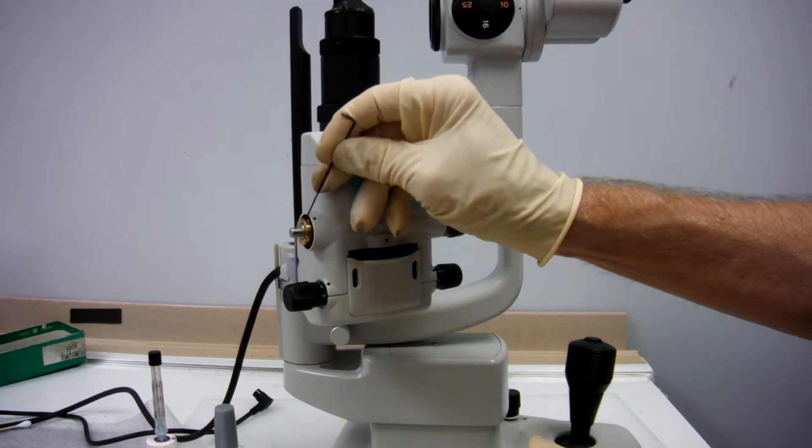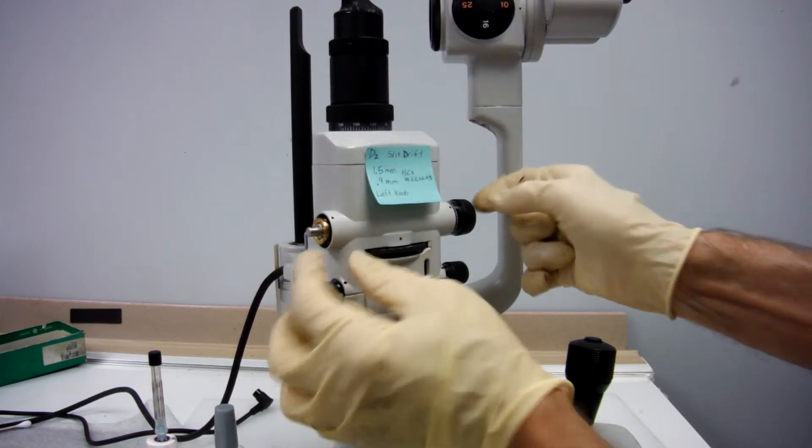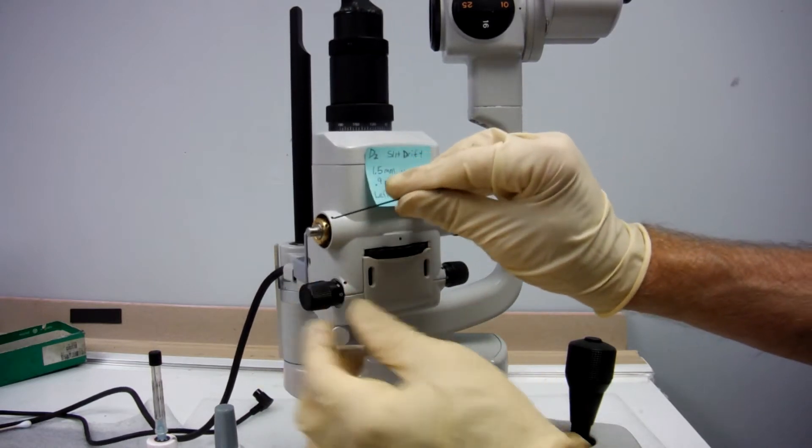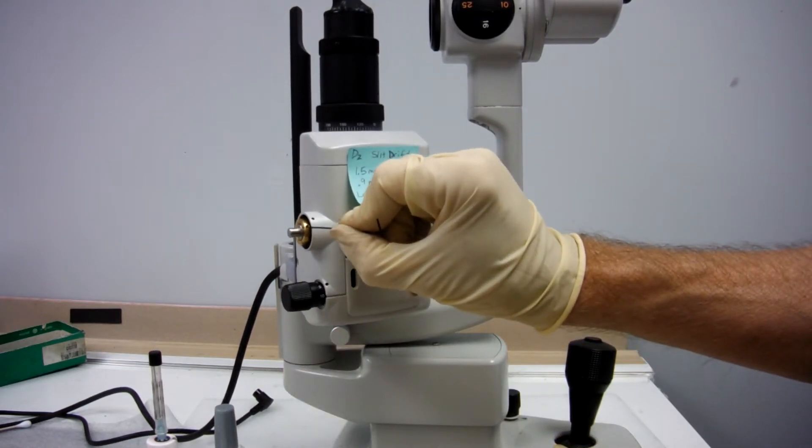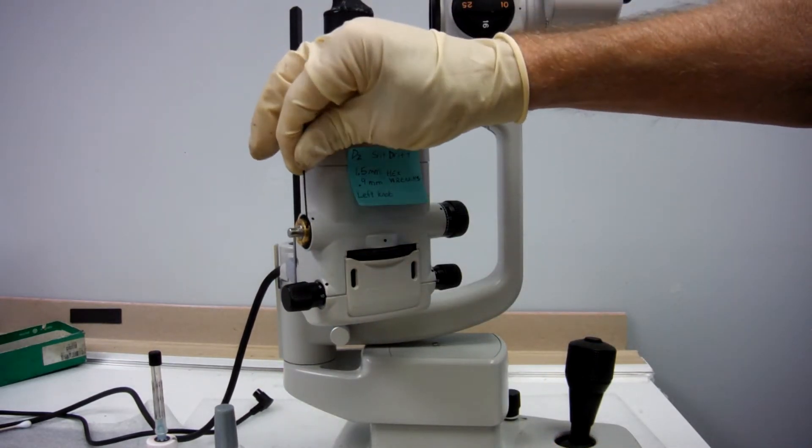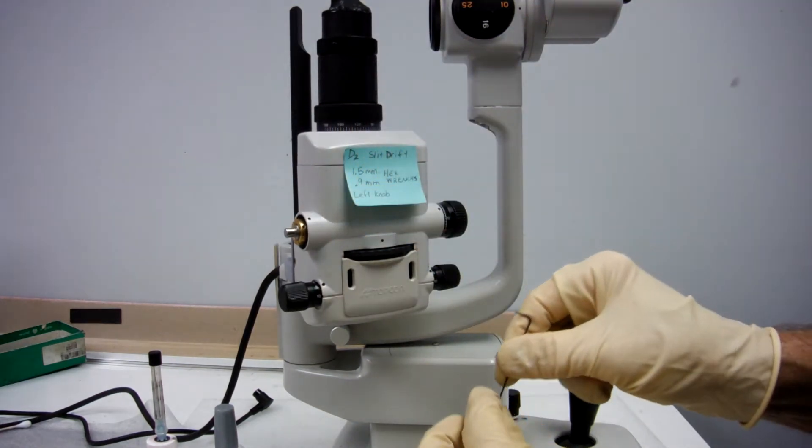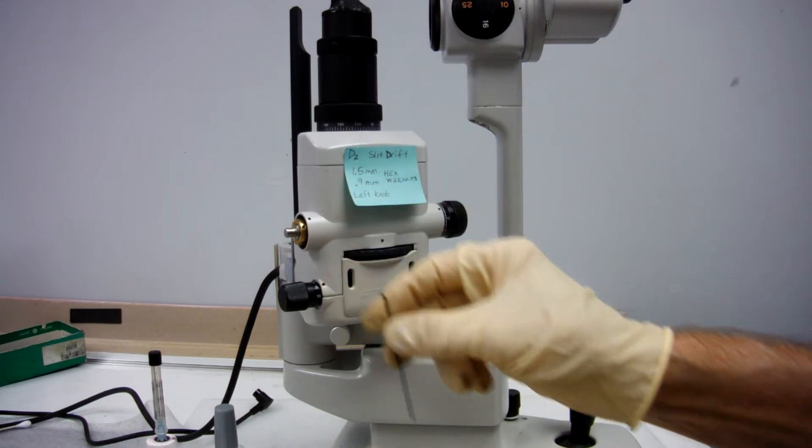And underneath here is another Allen wrench, and this is a .9mm or .035 inches. It's very small.